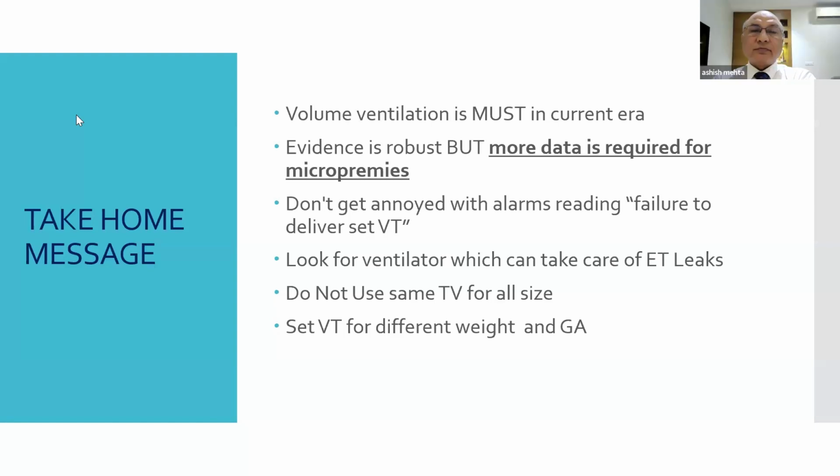Yep. So volume ventilation, but the problem is, in a government hospital or busy hospital where residents change over almost 3 times a day, and consultants also sometimes change, and the experience of the consultants will be different, and the residents will be first year or maybe third year SR. What do you advise? Volume ventilation or pressure ventilation?